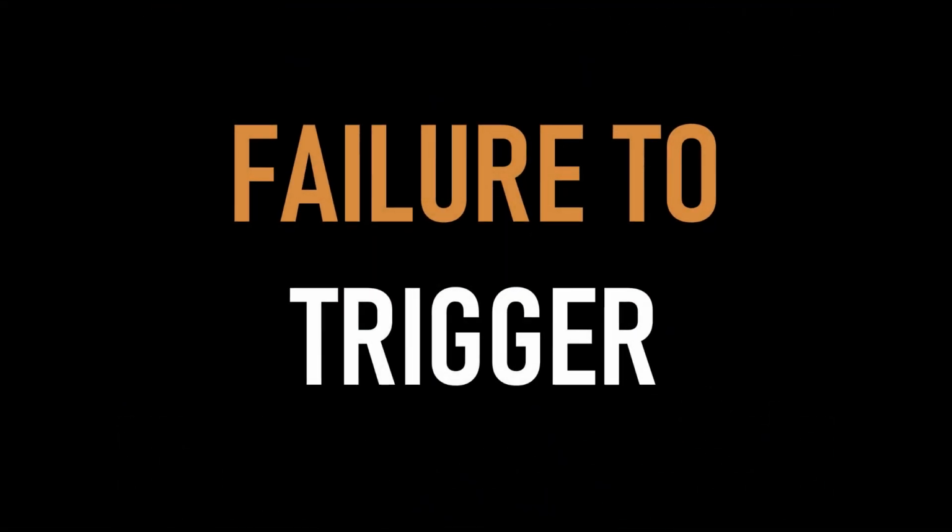Finally, I want to cover the most forgotten and misunderstood cause of failure to trigger. It is an issue that I believe occurs far more often than is appreciated, and it is rarely looked for at the time that the clinicians believe that the patient is ready to wean. That is the problem of Auto-PEEP.